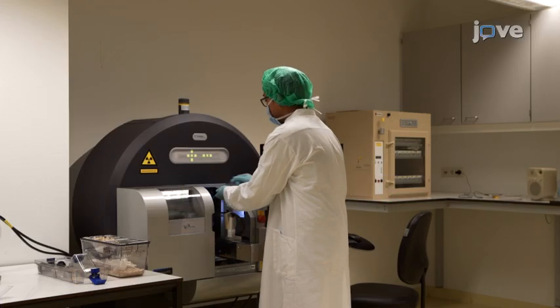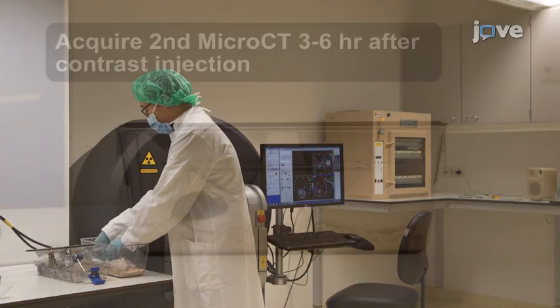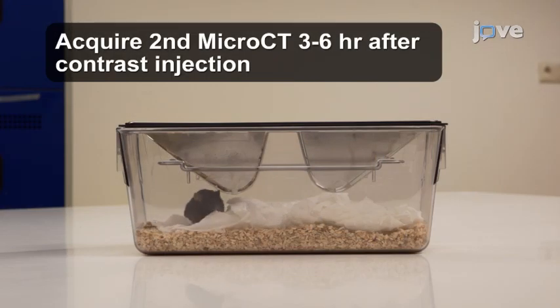Finally, remove the animal from the scanner and monitor it until it is fully recovered.